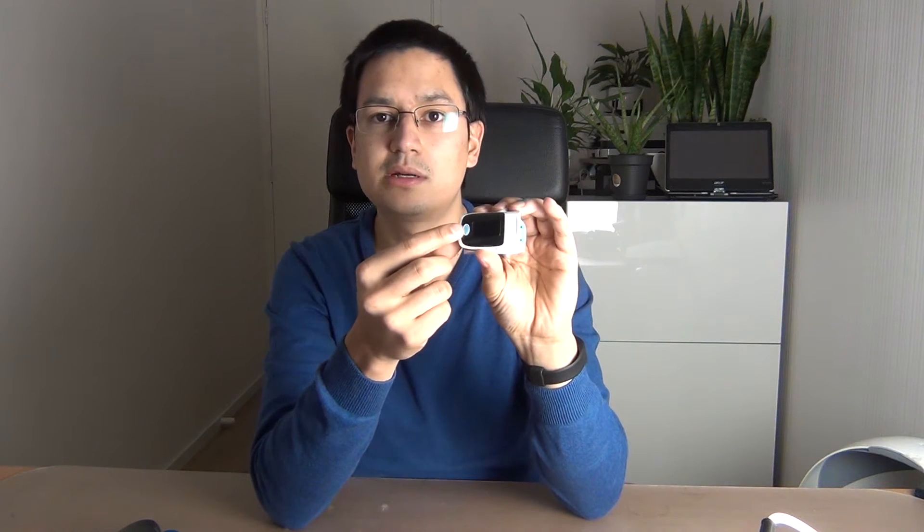I'm going to press the button now and the device will start up. It will start with some information on the screen, and then you can put it on a finger and it will start measuring.